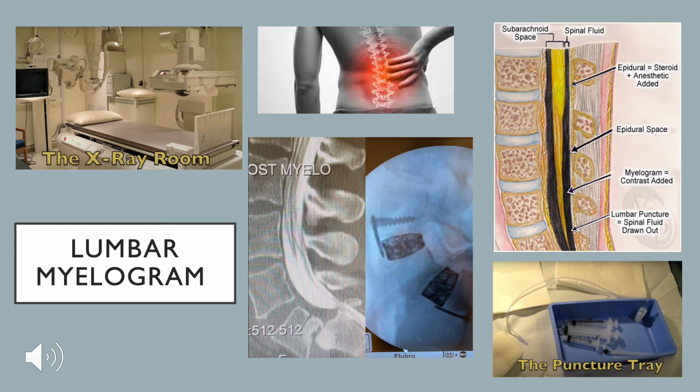Ultimately, a myelogram is used to highlight any potential nerve root compression or masses, which involves many preparations before, after, and during to ensure everything runs smoothly.